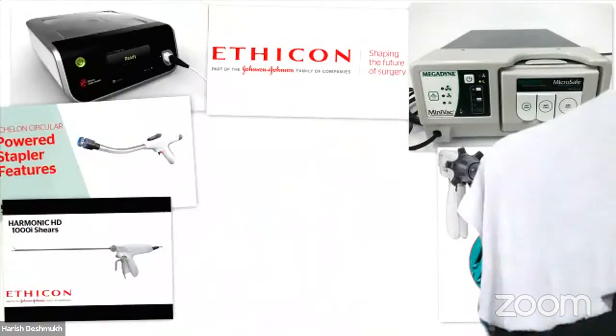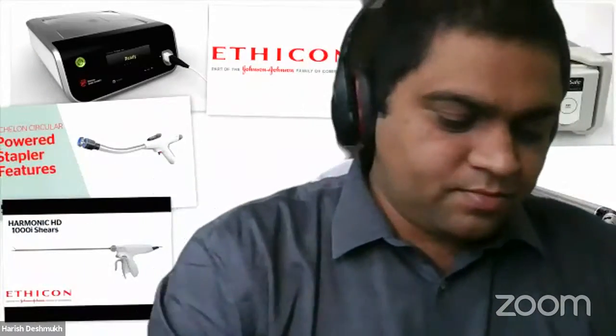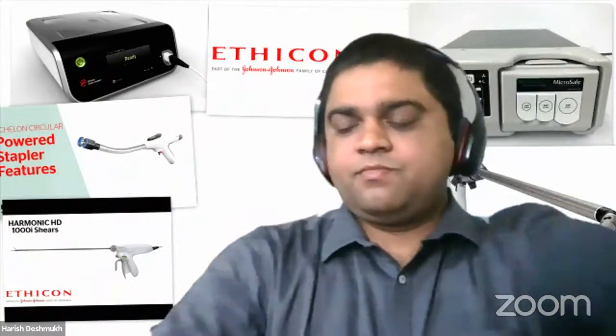See, I'm asking this because most of the time we have this problem. Unless we get an assistant who knows about loading and unloading the staplers, it becomes a difficult task for us. Otherwise we have to clean our gloves and go and load it. I understand that, sir. You must be having tubes, no? Plastic tubes are there, sir. Just load it in that stapler and show till what end the tissue should be there, so that it can cover the whole length of the cartridge.